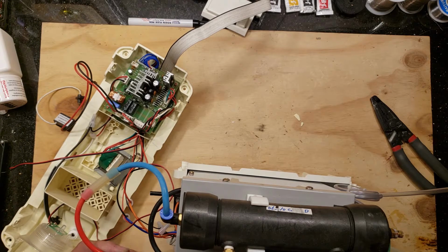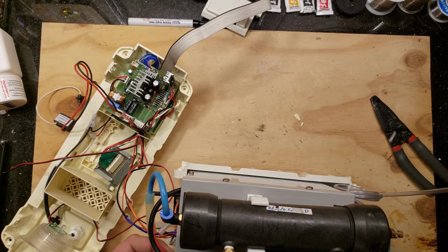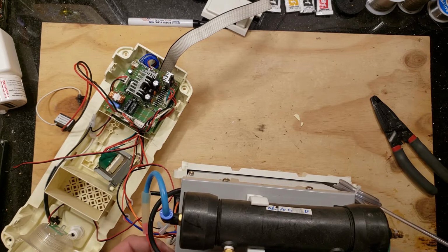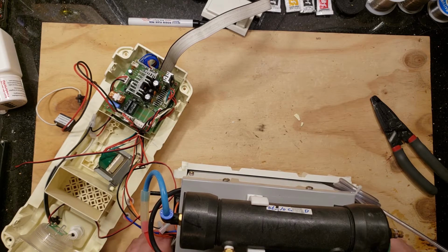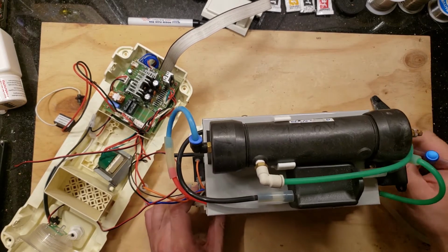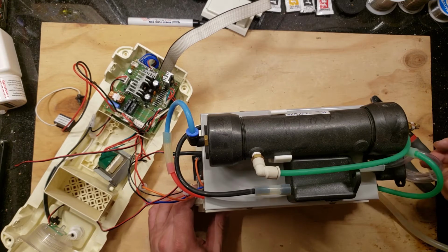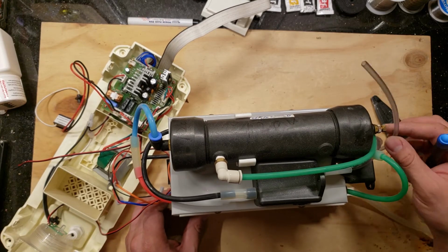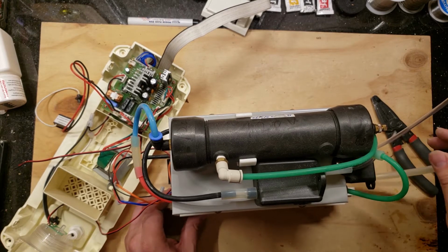Oh, this thing appears that it just popped out. It was pumping, so I wonder what the heck was going on. So I guess I'll test this and see if I can make it work. It's got to produce some slightly enriched oxygen. Now this was just floating around inside the case. This was the output.